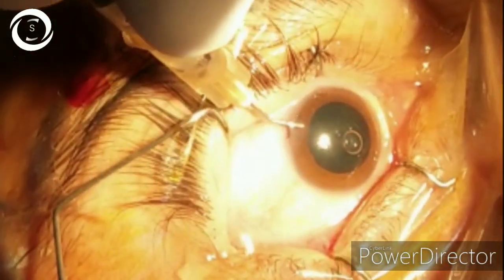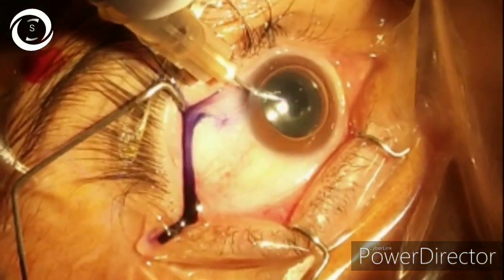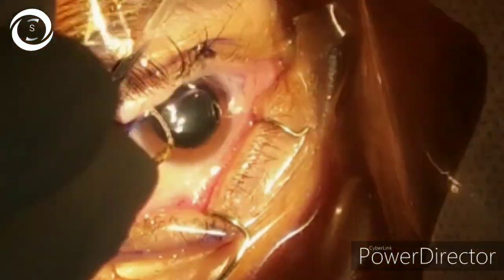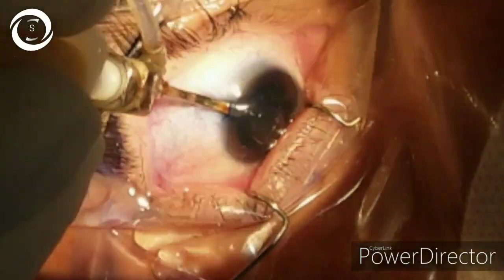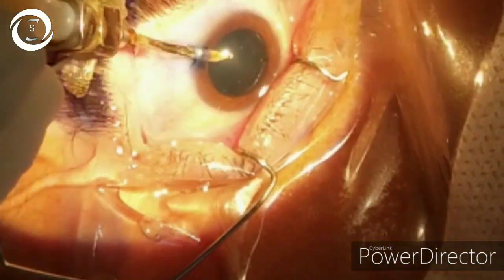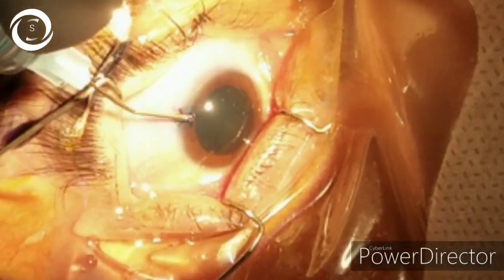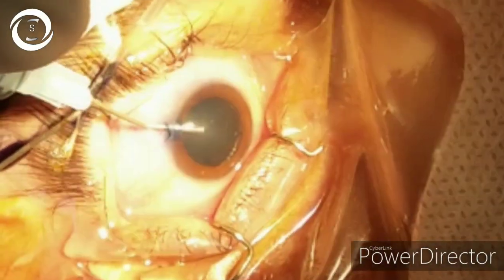Now you can put trypan blue to stain the anterior capsule for better visualization. With an irrigating cannula, remove the air and the stain. Now put the viscoelastic to deepen the anterior chamber.